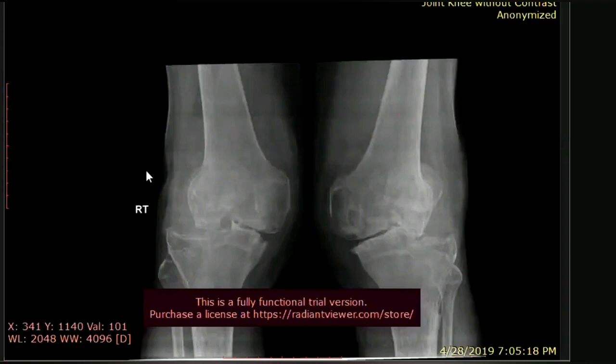Okay, so the X-ray has been described by two candidates, and thanks for the participation and good luck for the exam. I would advise you to revise the list of musculoskeletal arthritis descriptors, then differentials and final diagnosis.